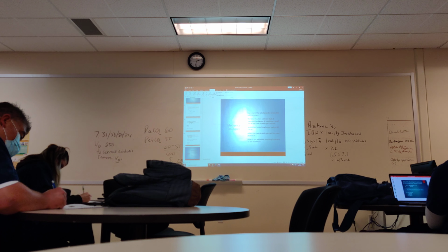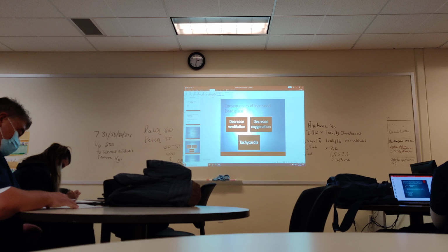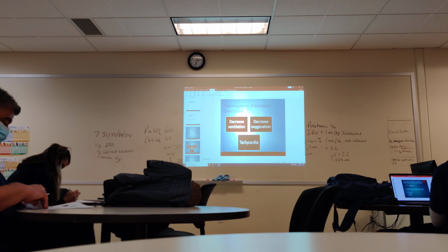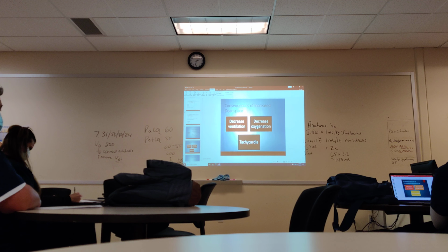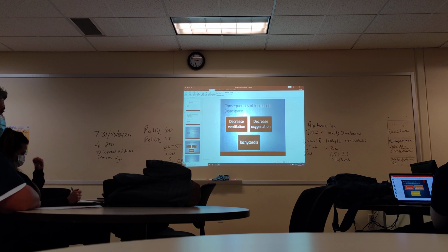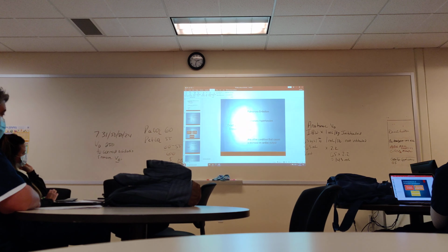Remember, we use pressure support in a spontaneous breath to help the patient overcome all that crap in order to breathe. Okay, where they're comfortable and not sucking wind so hard. Now, if you don't deal with the dead space situation, lots of bad stuff's gonna happen. One, you're gonna have decreased ventilation. You will eventually have decreased oxygenation status, and the patients can become tachycardic, because now the body has to work harder in order to try to get the oxygenated blood around the body. Does that make sense? Any questions so far?